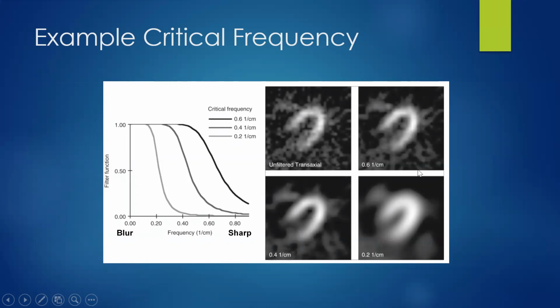So at this point, this is the sharpest. It is more noisy. This has more noise in it. It has smaller objects. This is more blurry. This has more background in it. And again, background over here, small objects down here. Blur, sharp, grainy, fuzzy, okay?